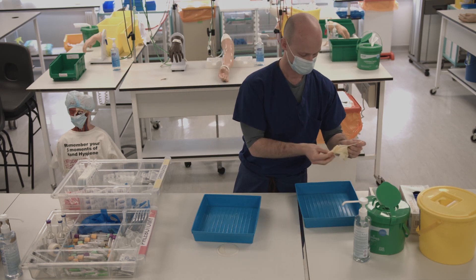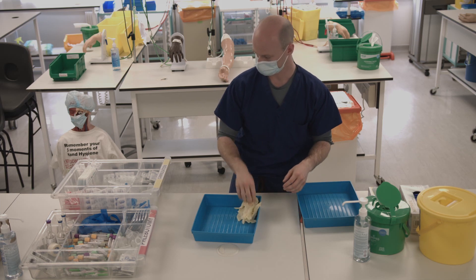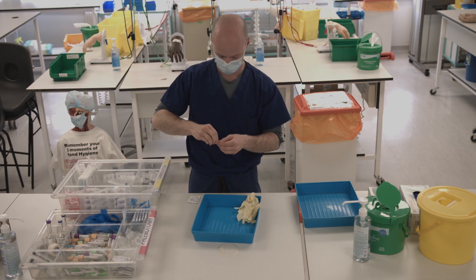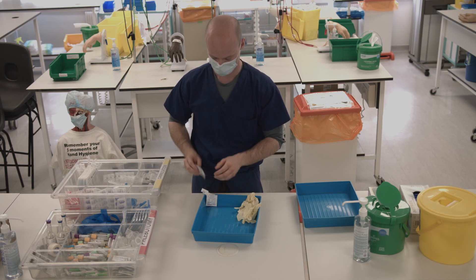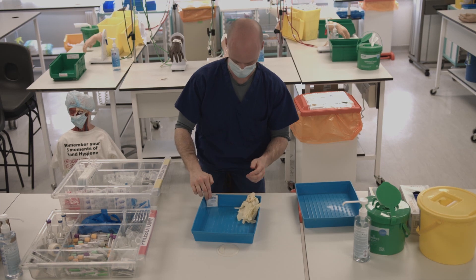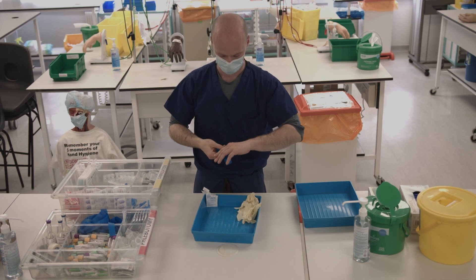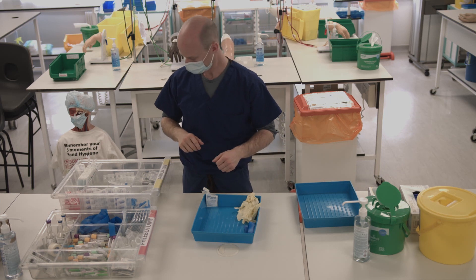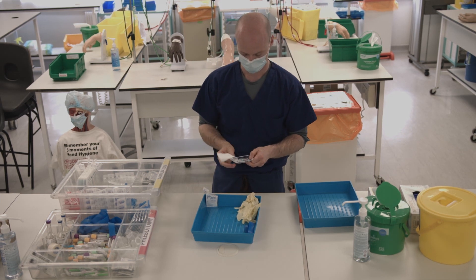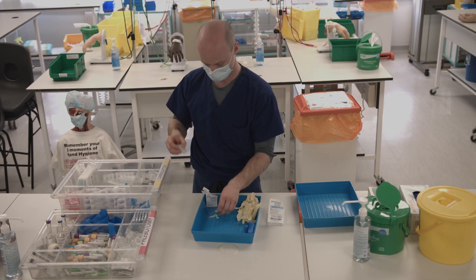Collect all the equipment that you'll need, discarding any packaging that you don't want to take to the patient's bedside. You'll need a pair of non-sterile gloves, four chlorhexidine wipes which you can open at this point, a tourniquet, and a butterfly needle which you can attach to a vacutainer.